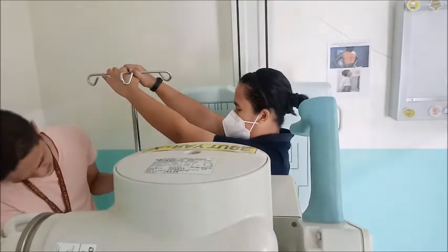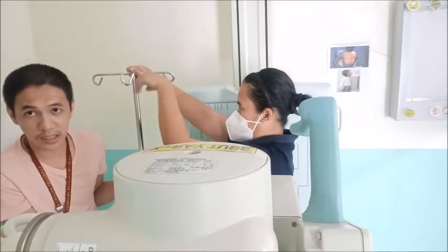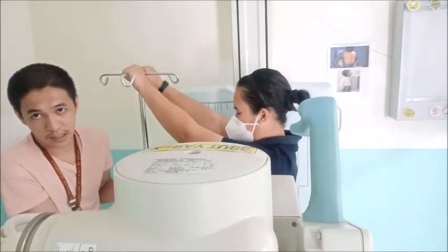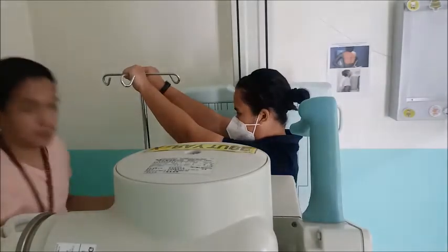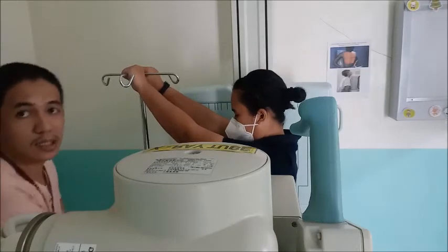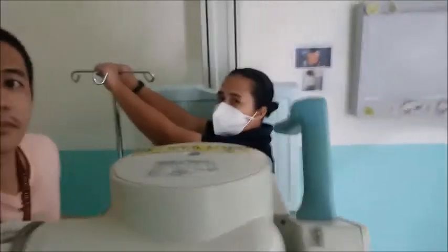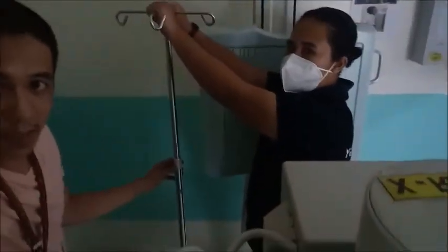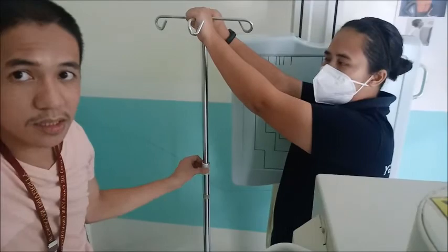If kaya na ni patient i-raise iyang upper limb, then you have to lock the IV stand in place. Kung makabantay mo, ang mga IV stand naay locking mechanism.